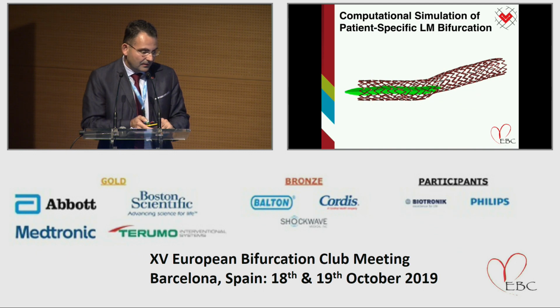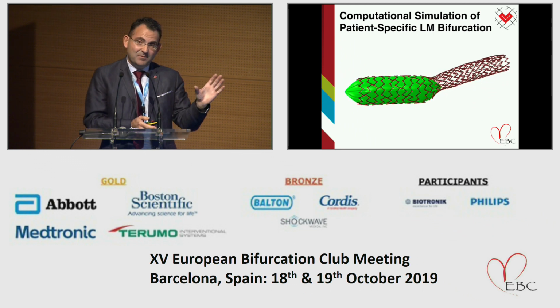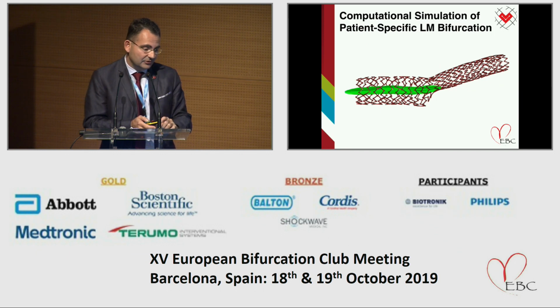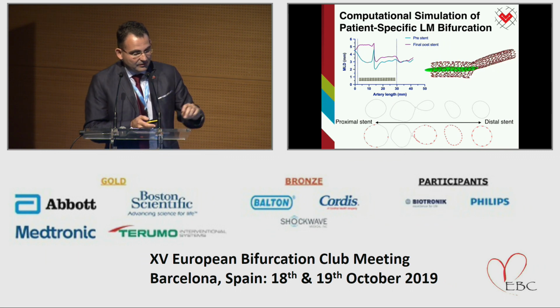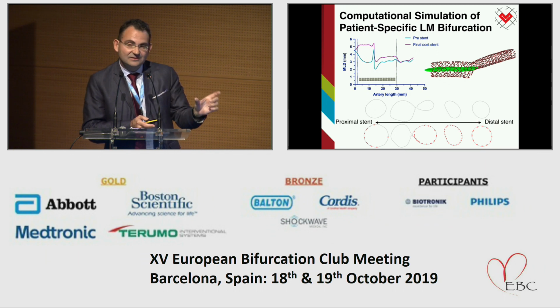You see the differential expansion, if it plays, of the proximal part of the stent, which, at 5, it's a 3.5 stent, goes to 5.0 proximally without losing the architecture, the shape, and good scaffolding of the side branch. So on the left-hand side here, I provide over the length, between the dashed lines is the stented part of the artery.